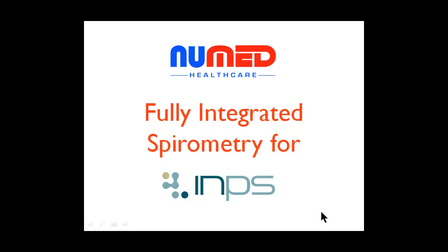This is a short screencast of the fully integrated spirometer for Vision from NuMed Healthcare.